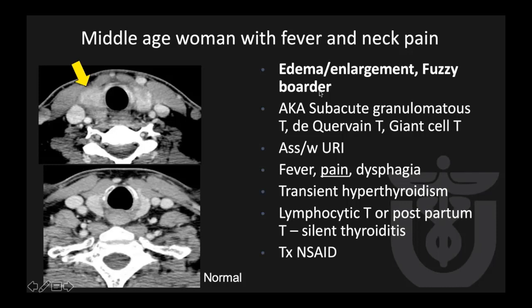Let's move on to infection and inflammation. Here is a middle-aged woman who came to the emergency room with fever and anterior neck pain. CT scan shows enlargement of the thyroid gland with a fuzzy border on both sides and surrounding edema. Compared to normal thyroid tissue, which has a well-demarcated border with clean fat, there is clearly inflammation. This is a case of subacute granulomatous thyroiditis, also known as De Quervain thyroiditis, and it is usually associated with URI.